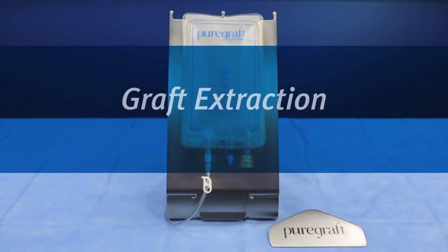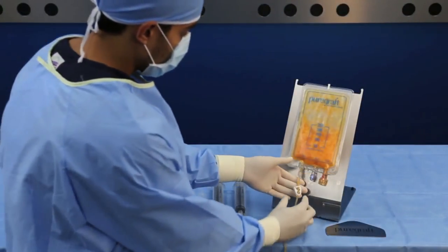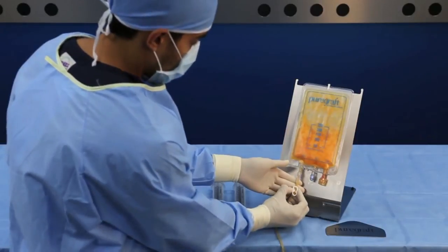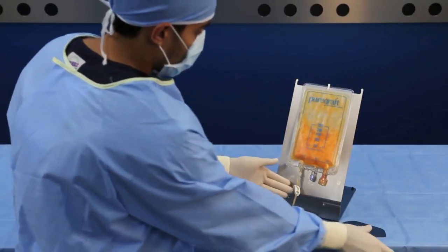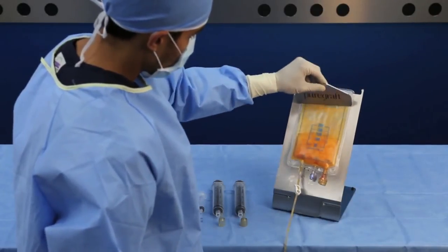Once the graft is washed, close the clamp to the waste bag. Then use the PureGraft slider to guide the graft towards the tissue port for graft extraction.